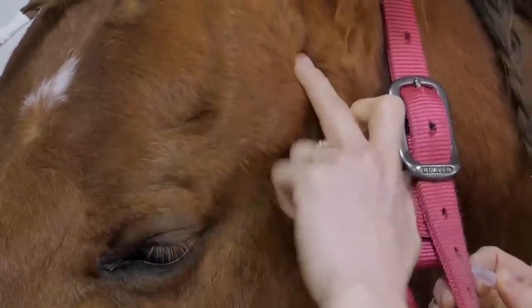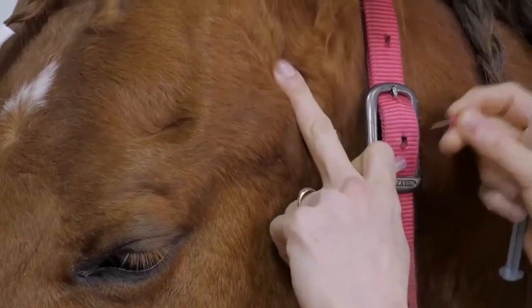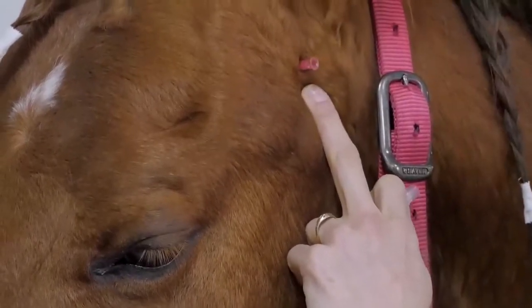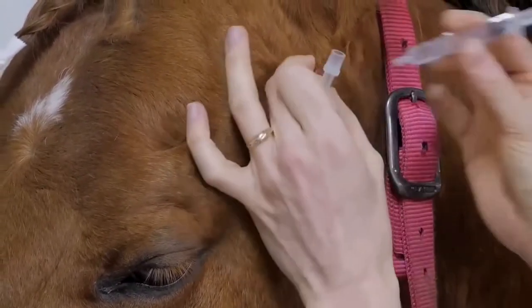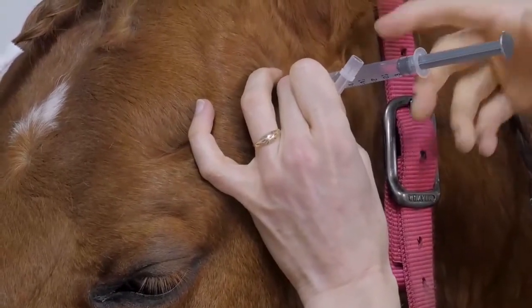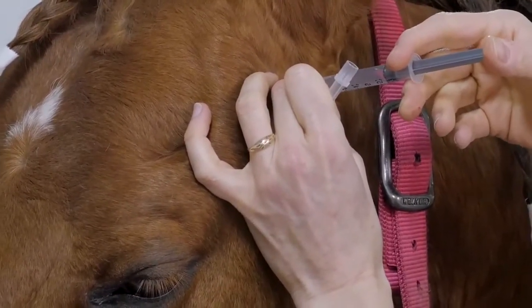In large animal species, the auriculopalpebral nerve block should be performed prior to tonometry to reduce pressure on the globe from the eyelids. Additionally, sedation and an elevated head position are recommended for tonometry in the horse.